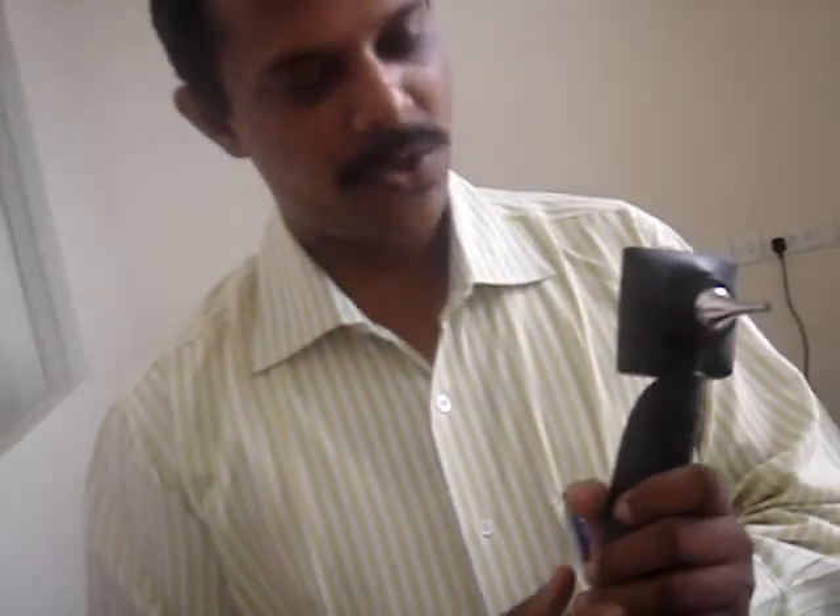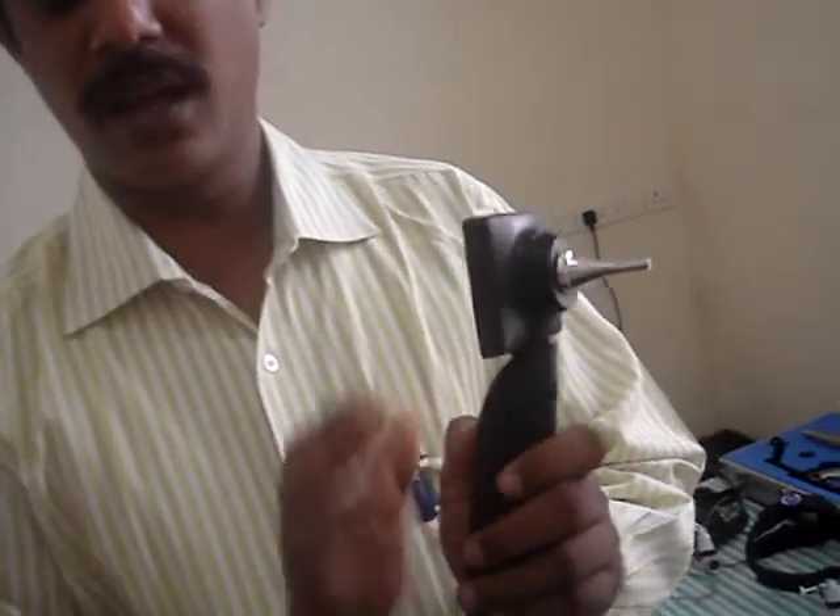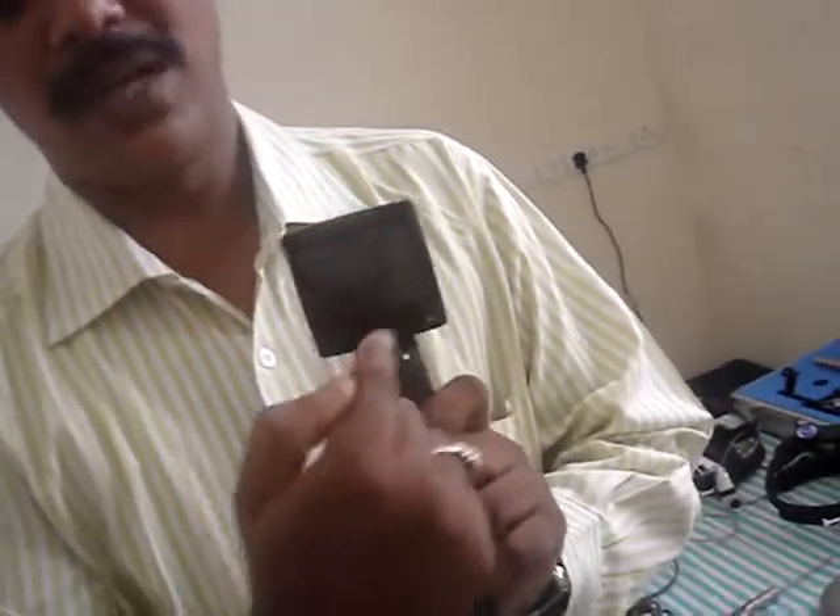We have Shashi here from Mansari who has got a fantastic otoscope with a monitor. Can you just tell us something about that, Shashi? This is a new product we introduced in the market about 3 months back. This is called the auto otoscope with the inbuilt camera and inbuilt LCD monitor.